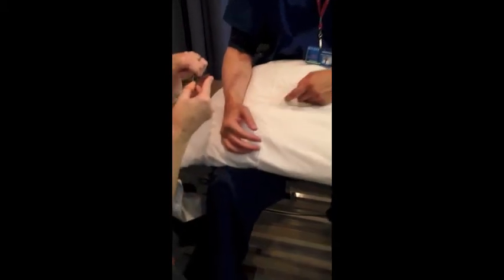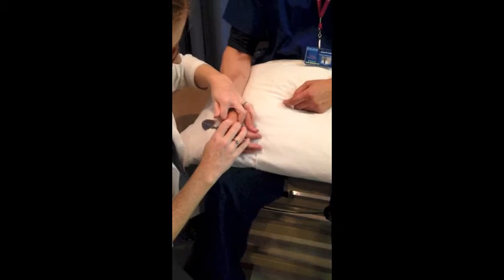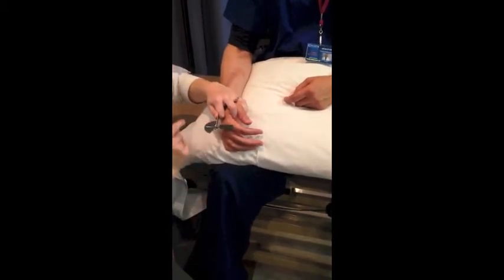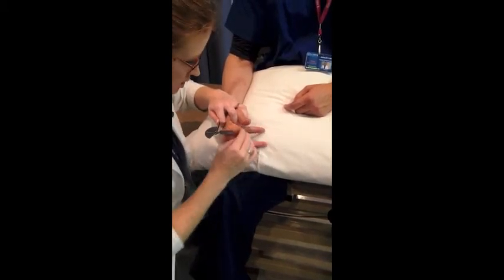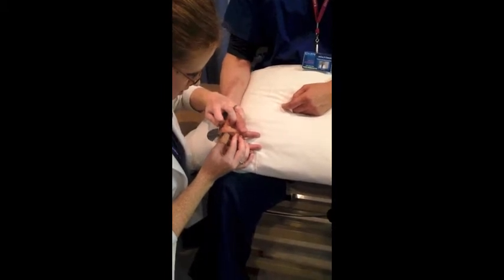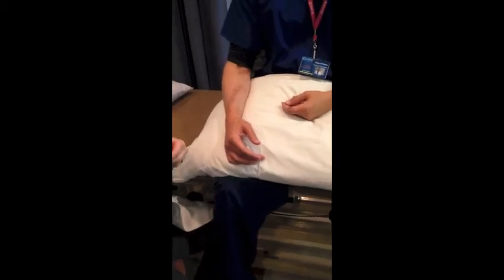That's above 90. I'm going to be careful not to let this touch the patient's skin, so I'm going to hold it parallel to the metacarpal. I'm going to have the fulcrum lined up just at the joint, and then I'm going to let this move parallel and relax. And we have — 99.